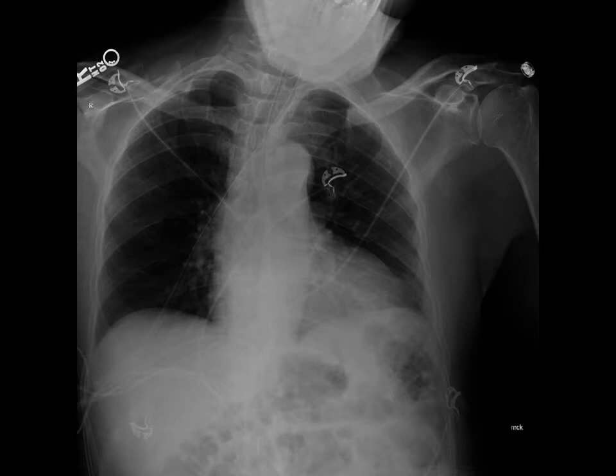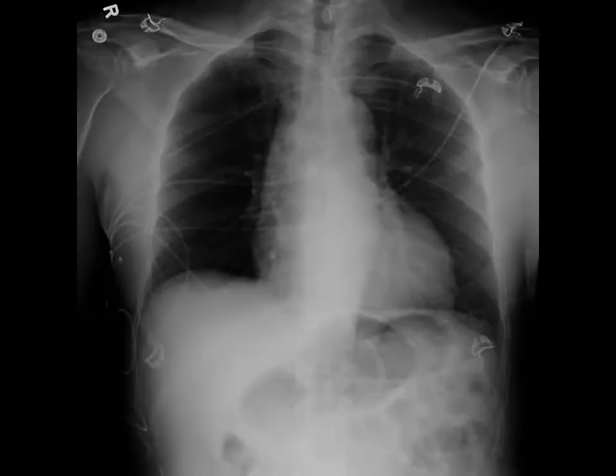This is a 65-year-old male. He has an enteric tube that's been placed, and the chest film has been ordered to evaluate its positioning. It's kind of hard to see on this display, but the NG tube terminates here. Of course, in this position you would recommend advancement. After advancing the tube, another chest x-ray was taken. We can see the line in the stomach bubble now, with the tip terminating at least 10 centimeters beyond the gastroesophageal junction.